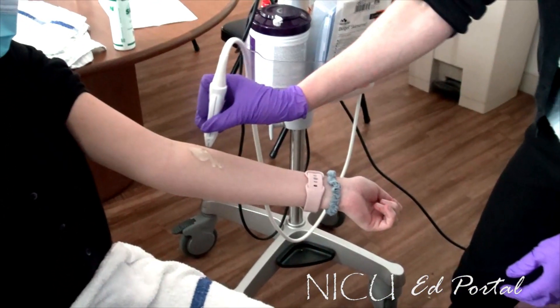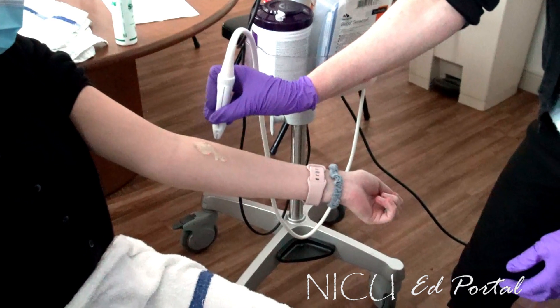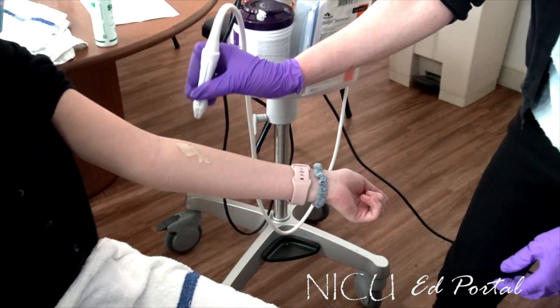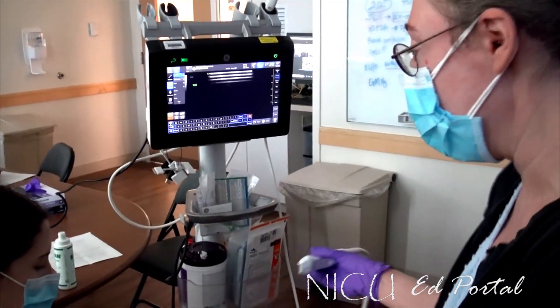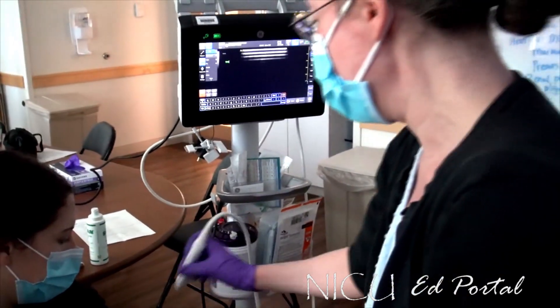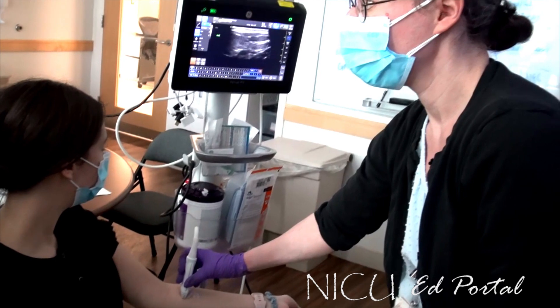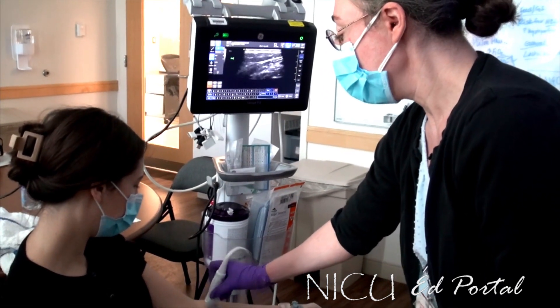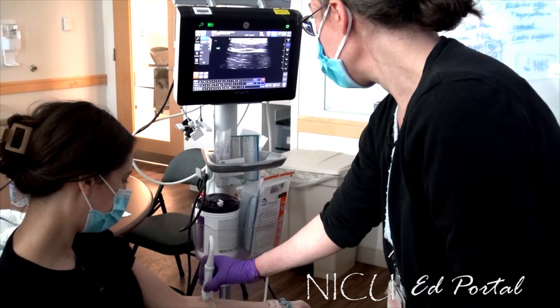We're going to be either transverse to the patient. The other convention is that you always stand on the patient's right side if they're supine. We do that a little differently for the head because we have to accommodate the isolette and the equipment, but in general you're on the patient's right and your thumb is either to the patient's right side or to the patient's head. We're using the gel to get really good contact.